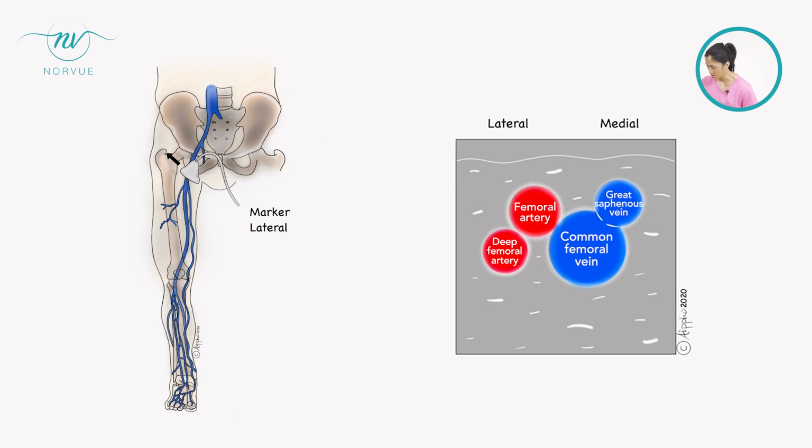And as you can see on this illustration, there are some white things here. Is that a pathology? No, it's not. It's actually just a valve between the veins.